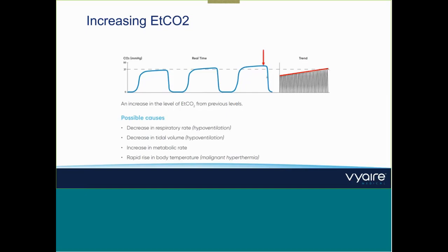And this can also, even if the rate is not changing, be a reason for increasing CO2. And what I would always do is, because watching the ventilator, you see only 3 CO2 waveforms, and you see a certain level of EtCO2, and you also have a numeric value. But more interesting is what CO2 is doing over time. So I would always recommend to your customers that they also should have a look at the trending data, because the trending data gives you not a feeling, but a real monitoring over the course of time. So when the trend is showing you an increase over time, you know that there is something going on, especially when you didn't change the ventilation. So this is very important.